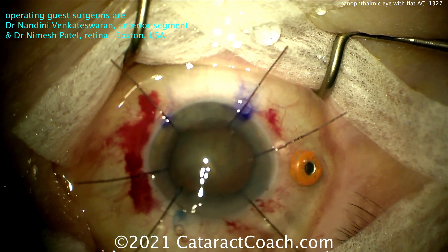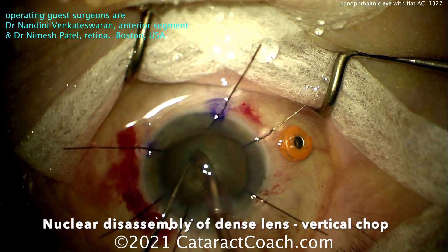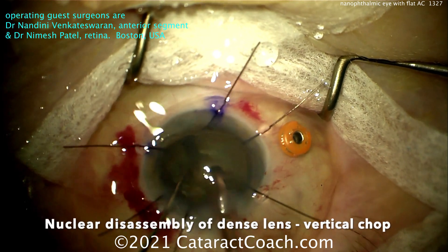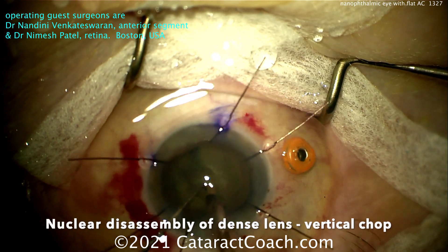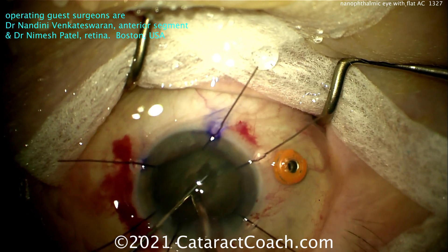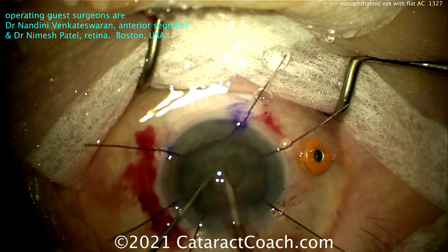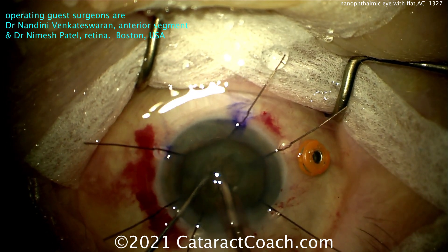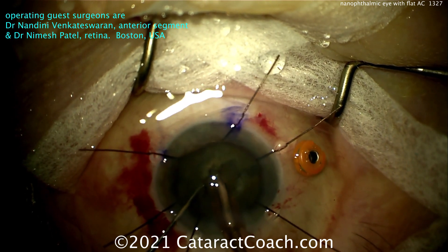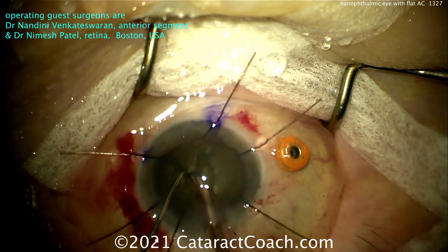In the U.S., very commonly, cataract surgeons do anterior segment and retina doctors do the rest. Here we have nucleus disassembly — a little bit of a groove, and then a vertical chop. Very nice splitting here. This is a stressful case, especially in a patient who's basically binocular. Taking your time is really a great idea. That little groove in the middle prior to the chop is really smart because it decompresses the densest central endonucleus and gives you a little more working room inside the eye. Really nice chop there.